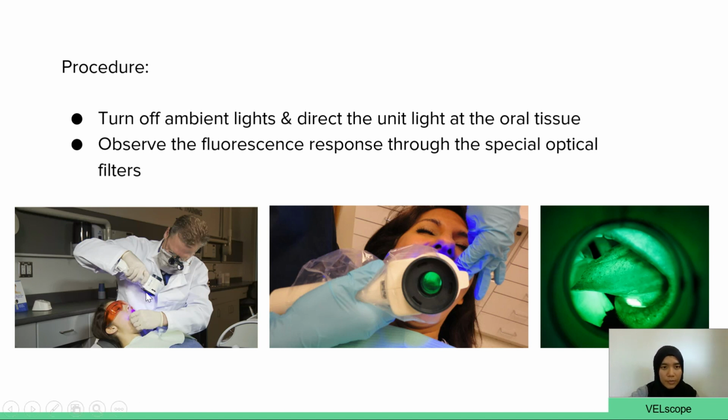From this picture, we can see that one end of the Velscope is where the blue light is emitted onto the oral mucosa, and the other end here is where the special optical filters are present, from which the clinician will look through it. So this is how it will appear through the Velscope.